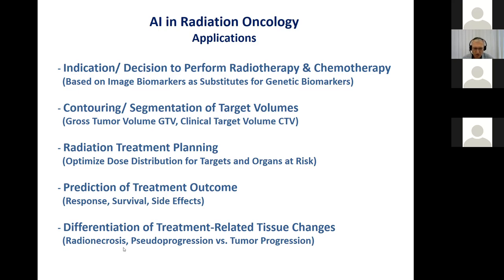So it may be that the changes are just a side effect of the treatment, which may be radionecrosis, so it's really dying of tissue due to the radiation. Or you might see a progressing tumor, but this progression is not always true. It might be just a reaction of the normal tissue. And then it's called pseudoprogression because it spontaneously resolves. And there are also means to differentiate between these image changes by artificial intelligence.